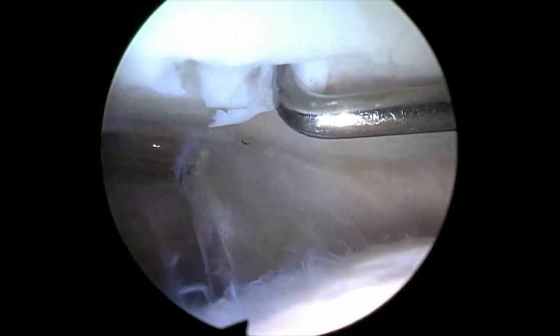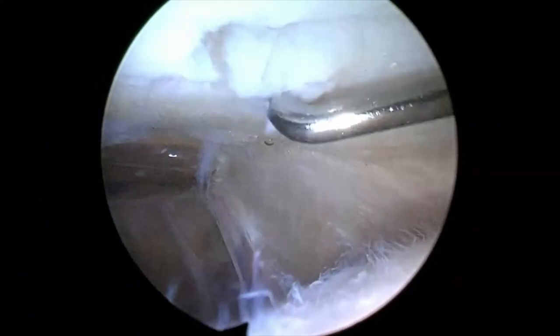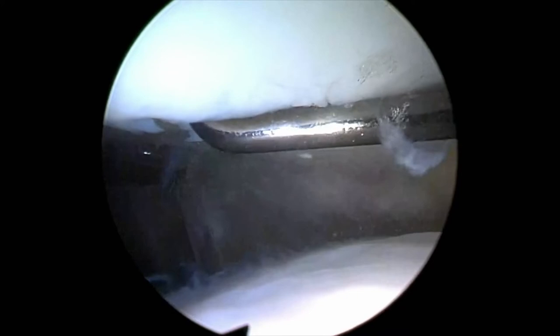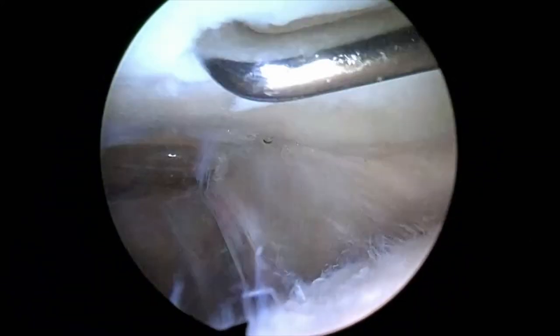Before you implant the cartilage cells, you must evaluate the defect and its position — this is very important to make implantation as easy as possible. You must ensure that all parts of the defect can be reached by your instruments. I would also recommend draining the joint before you start, so you can find out if synovium will protrude into the joint space. If so, you can reduce it with high frequency. If you reduce it with the shaver, it may bleed.